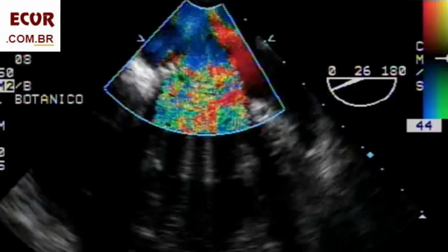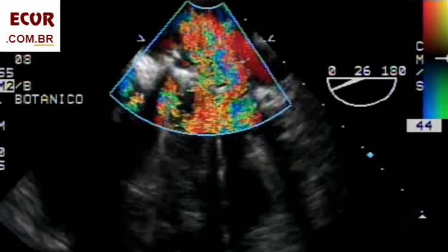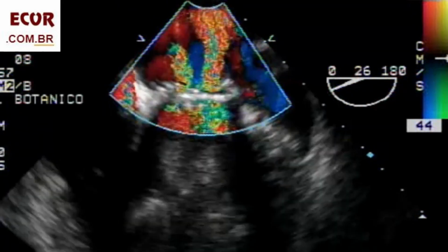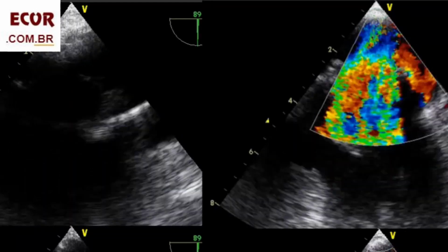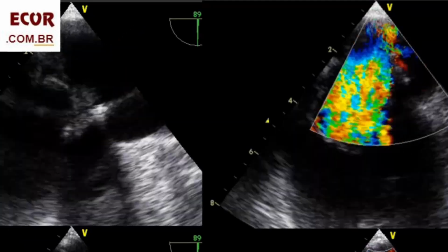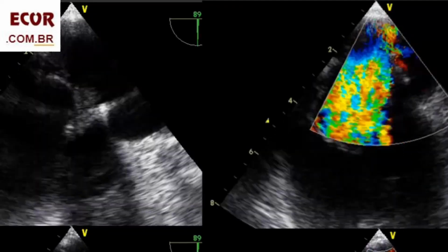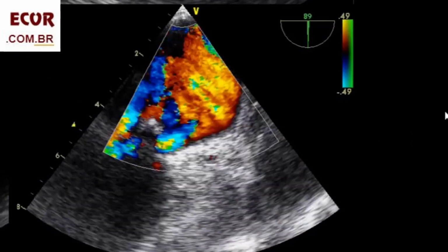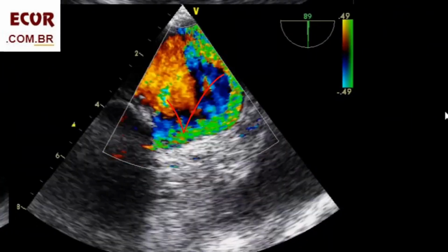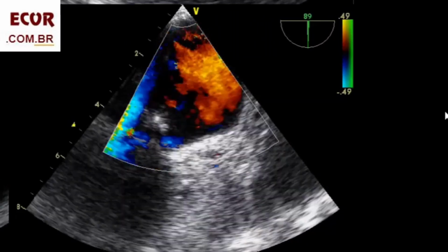Double disc mitral prosthesis with dense pannus-like tissue entering the sewing ring, moderate regurgitation. TEE of a bioprosthesis mitral valve with a vegetation of endocarditis. Color Doppler shows turbulence of regurgitation in the left atrium that did not seem to be coming from the orifice of the prosthesis. Careful searching depicted this paraprosthetic detachment with Coanda effect and an important paraprosthetic leak.